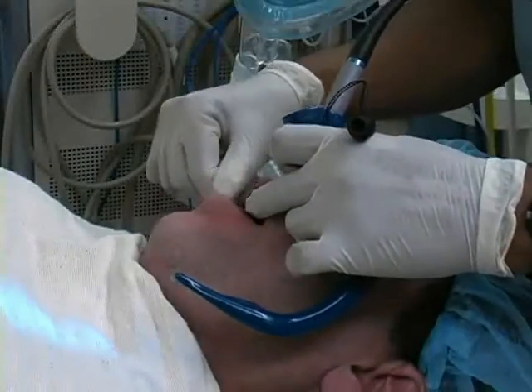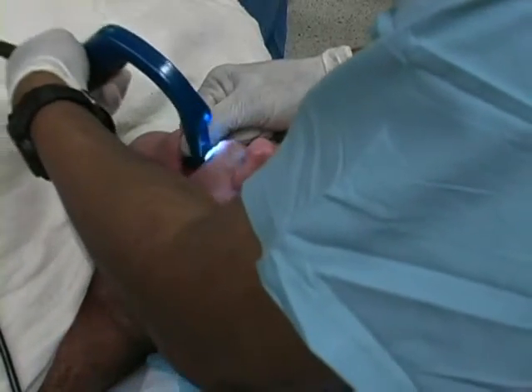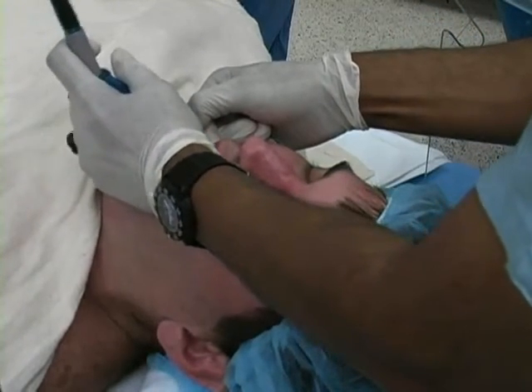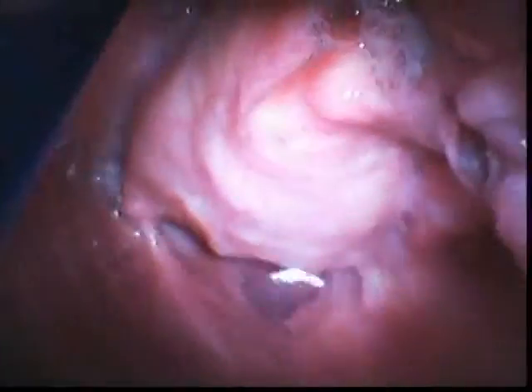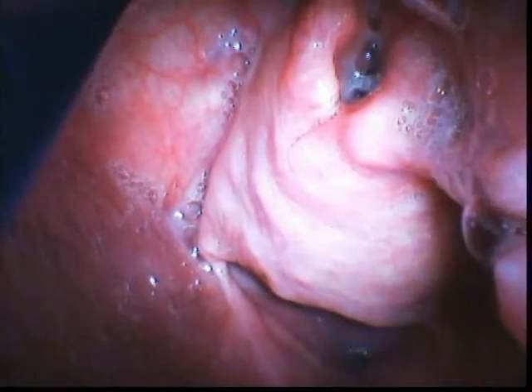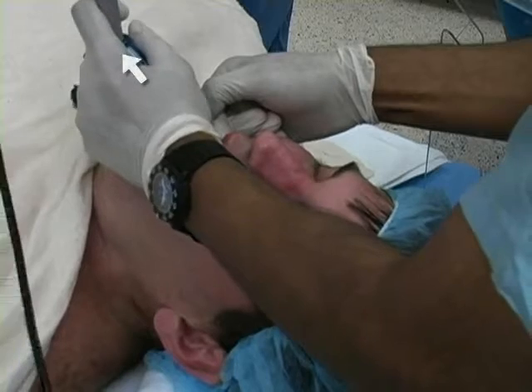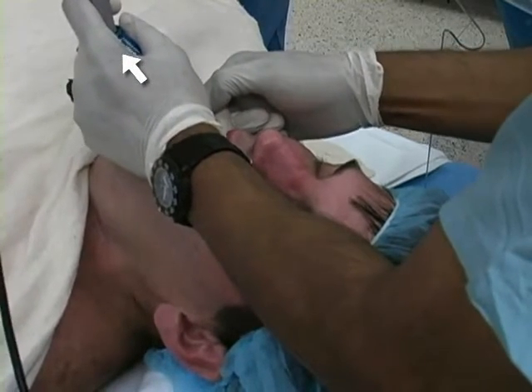Using your right hand, scissor open the patient's mouth. Grip the distal part of the laryngoscope handle in the left hand and gently insert it along the midline of the tongue. Slowly advance the blade into the vallecula looking at the display screen for guidance. When the tip of the blade is located in the vallecula, lift the GlideScope handle upward and outward to reveal the glottic opening.